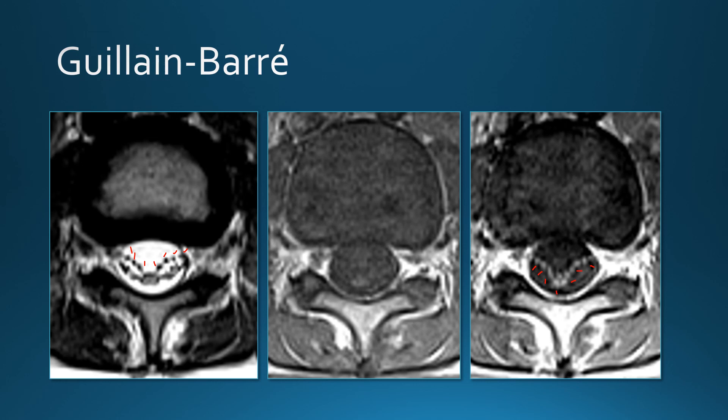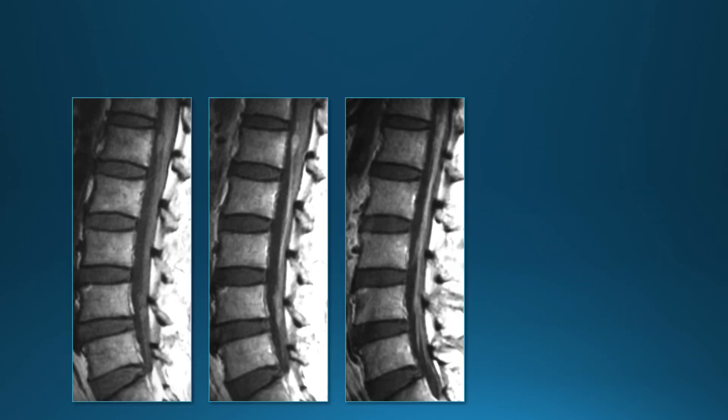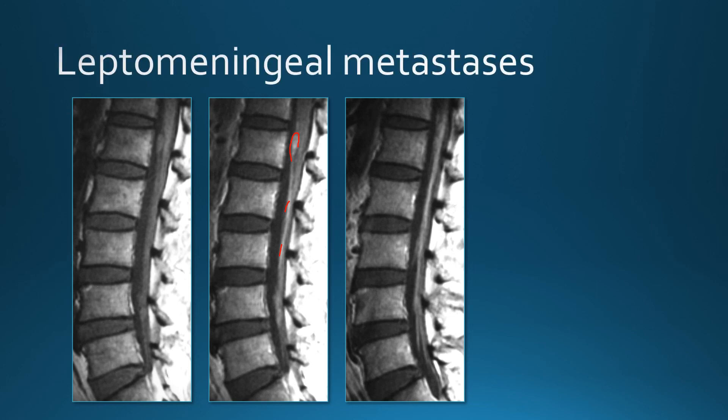The more chronic form, CIDP, is much less common and we don't image it very often, but you can see diffuse nerve root thickening. Another patient shows leptomeningeal enhancement with both linear and nodular appearance — the nodular component suggests tumor, and this was a patient with leptomeningeal metastases.